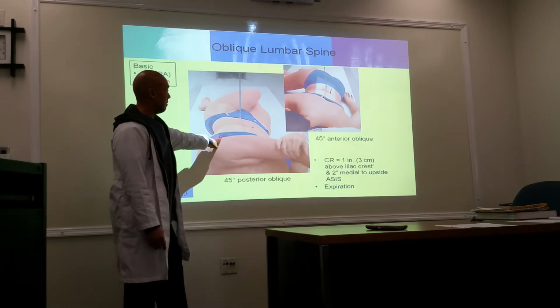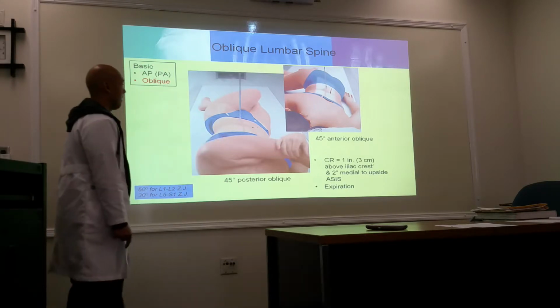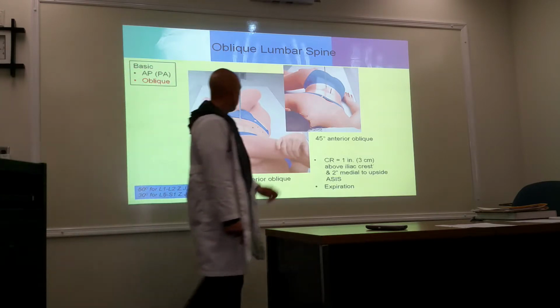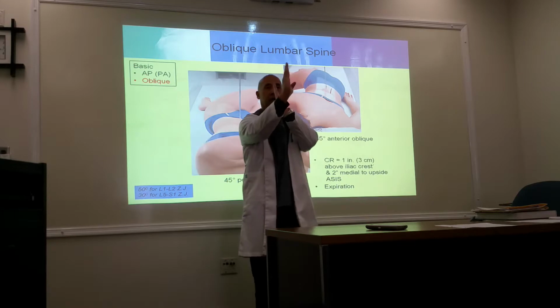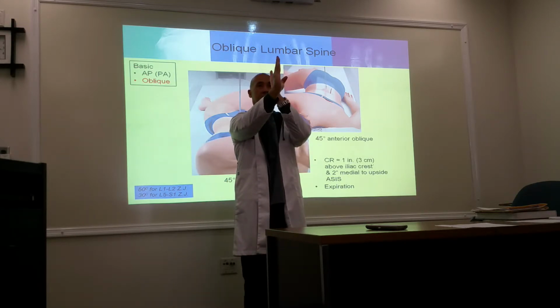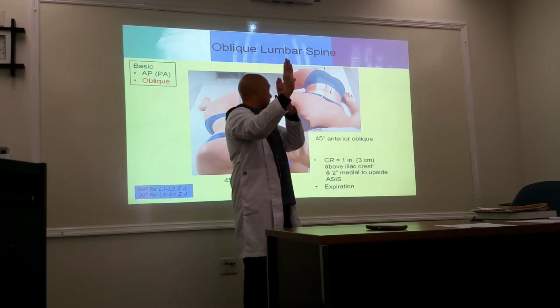And what we're looking for is on the bottom, the side closest. Why is our CR centered to the side above? Here's your spine. Here's your front. Here's your spine. Okay. I'm going to place them in the RPO position.